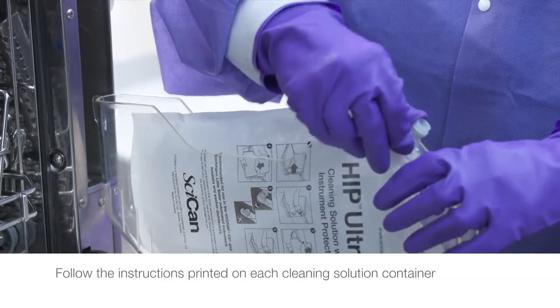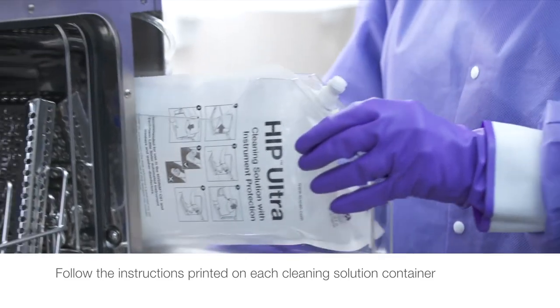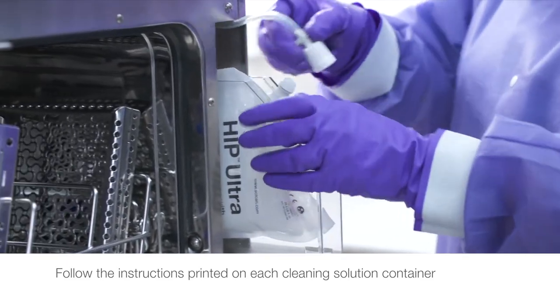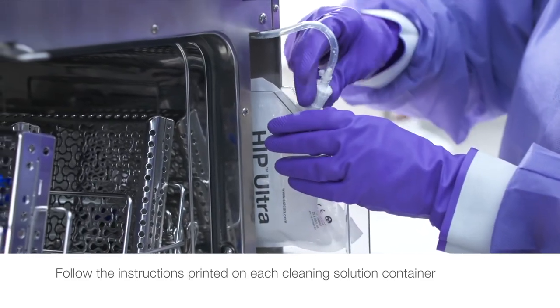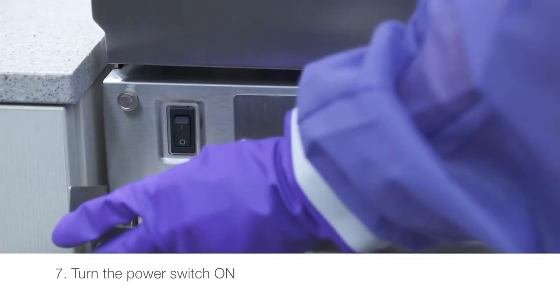Follow the instructions printed on each cleaning solution container. Close the door. Turn the power switch on.